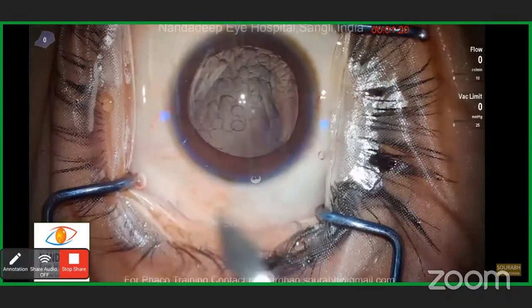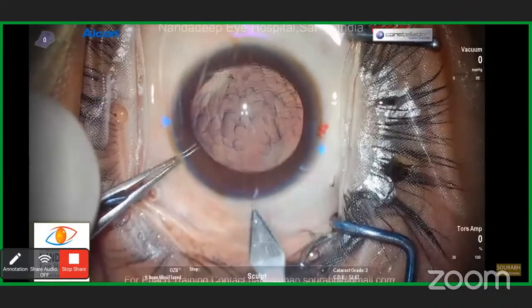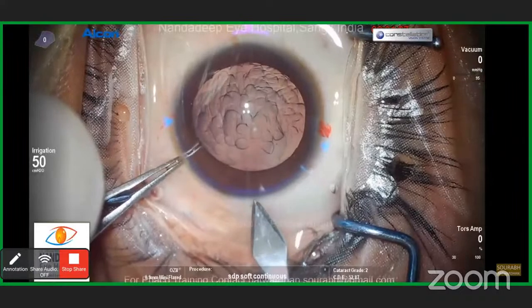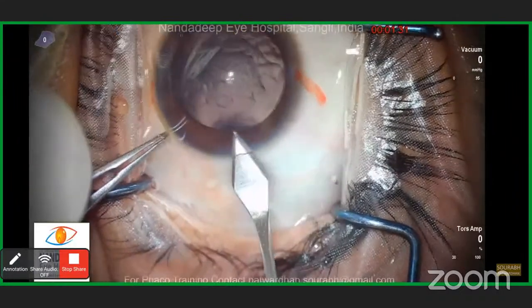So what is the indication for doing IPCL in case of a keratoconus? Anyone else? What are the special precautions that you have to consider?